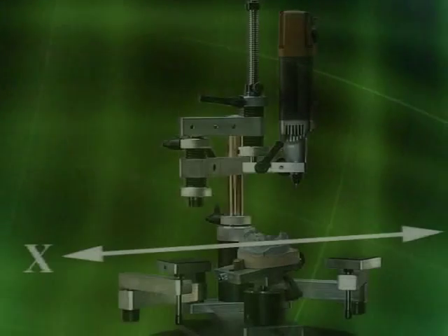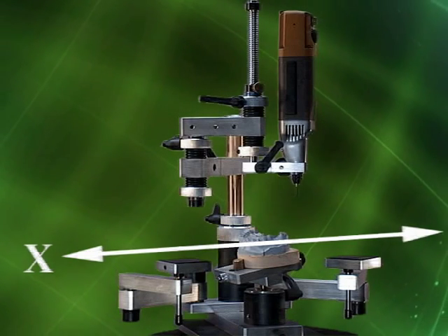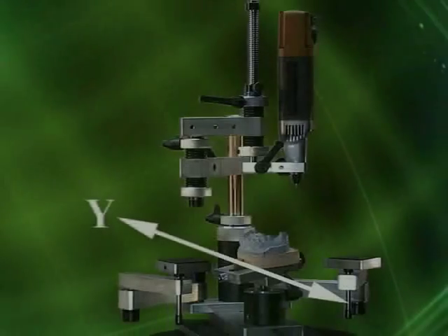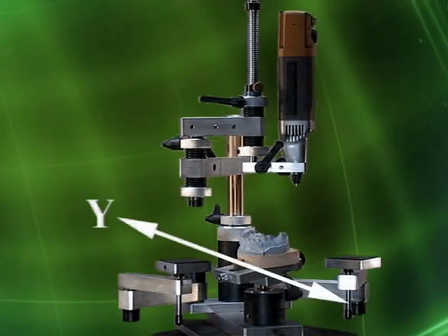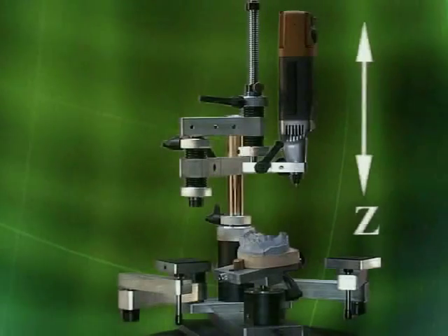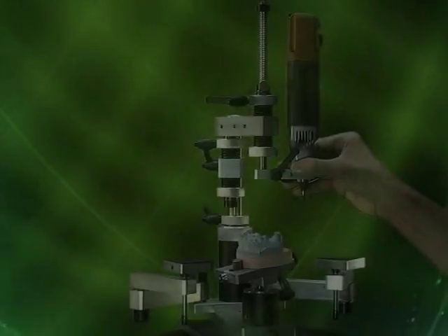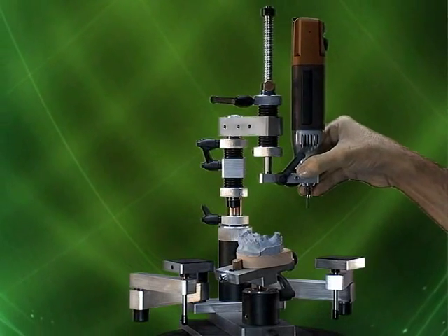In the industrial world, milling machines have three primary axes: the X, which will be left and right; the Y, which will be towards you and away from you; and the Z, which will be up and down. In this video, we will be focusing primarily on the Z-Axis.